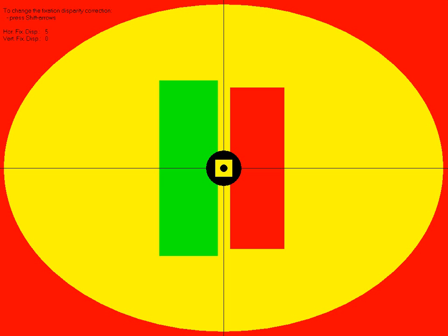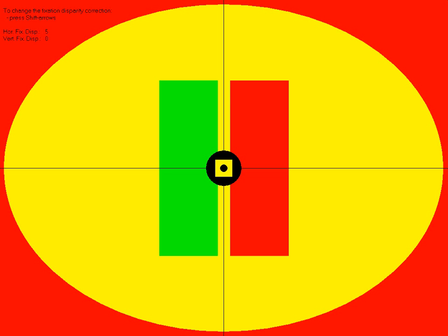If the left rectangle is perceived larger, the left arrow key needs to be pressed. If the right rectangle is perceived as larger, then the right arrow key needs to be pressed. If the patient really cannot make a choice, the E key, or both arrow keys, can be pressed at the same time to denote that the patient saw the rectangles as equal in size.